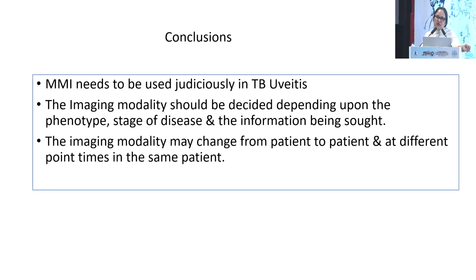It should not be just a frivolous imaging that you want to do everything for everybody because you heard in meetings people talking about Muller cells or hyalocytes or something. They are good for understanding the disease, the pathogenesis, the newer molecules, but they are not to be extrapolated into your clinical practice day to day.